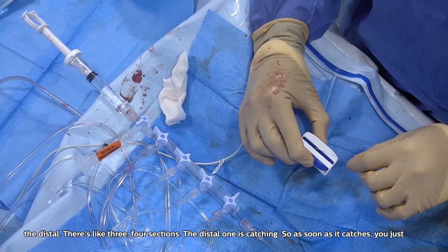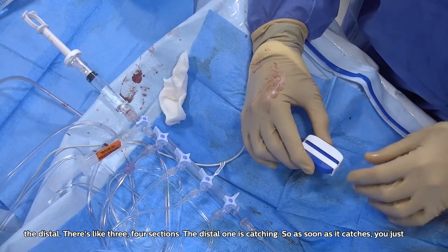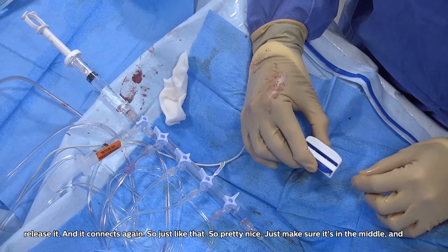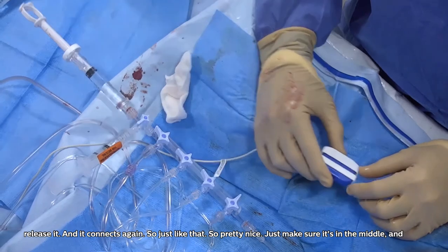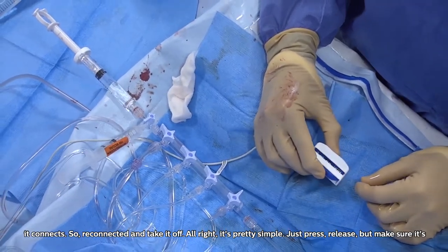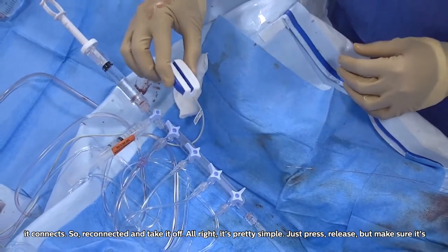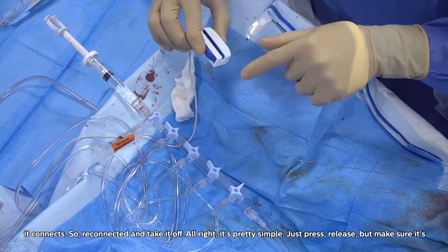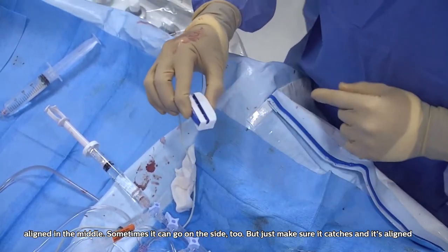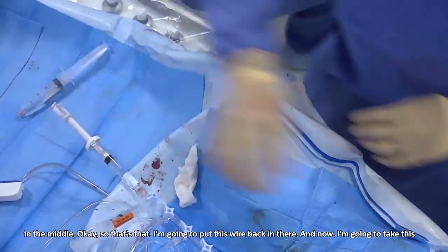There's like three, four sections. The distal one is catching. So as soon as it catches, you just release it and it connects again. So just like that. So pretty nice. Just make sure it's in the middle and it connects. So reconnecting and take it off. All right, it's pretty simple. Just press, release, but make sure it's aligned in the middle. Sometimes it can go on the side too, but just make sure it catches and it's aligned in the middle. Okay, so that's that. I'm going to put this wire back in there.